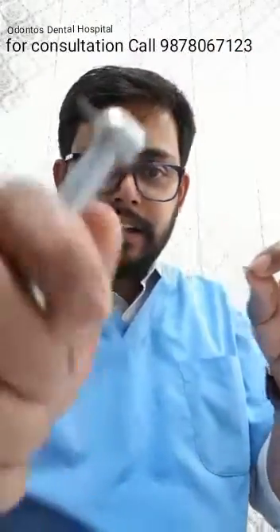You have to take this kind of a bur, flame shape bur, just trim the ends of the bur into a hex using a carbide bur, right? Mix some cold cure resin, just make a ball of it and insert this inside.